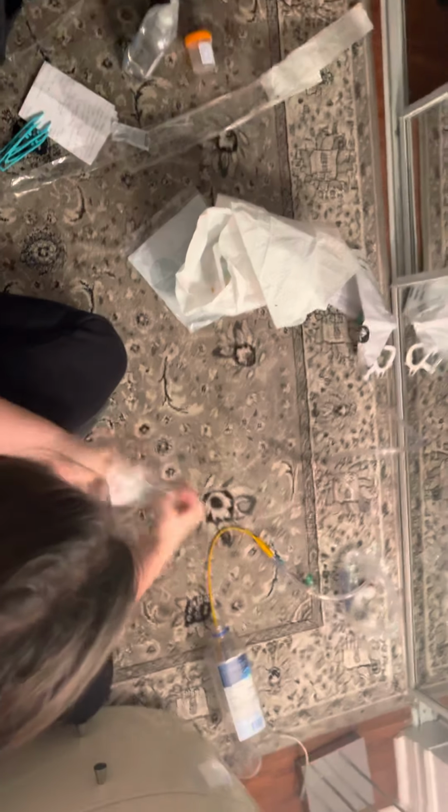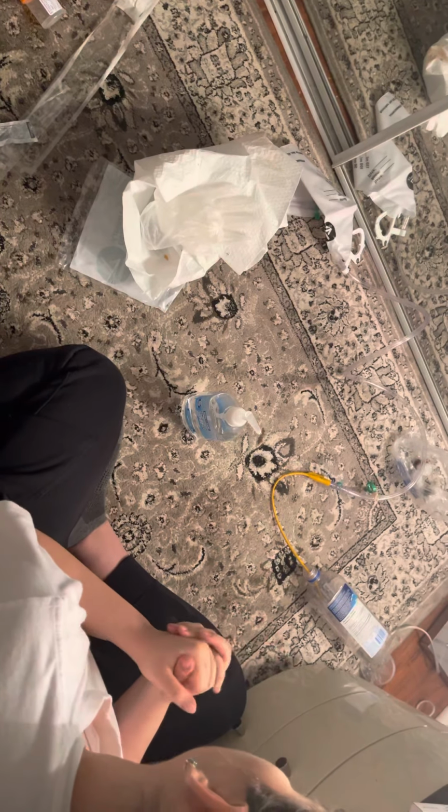So once I've done that, I'm going to take off my sterile gloves. I'm going to dispose of all of this and perform hand hygiene. So for documentation: inserted indwelling Foley catheter number 14 as per doctor's order, inflated the balloon with a syringe at 5 cc's. Drainage had no odor, straw-colored urine was clear. Patient tolerated the procedure very well, and I'll keep monitoring.